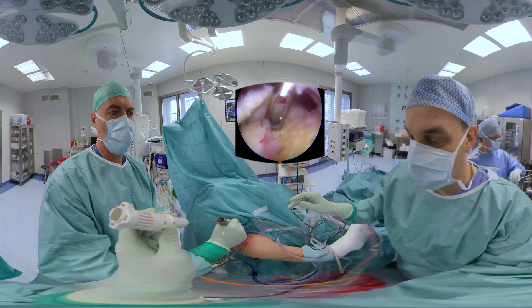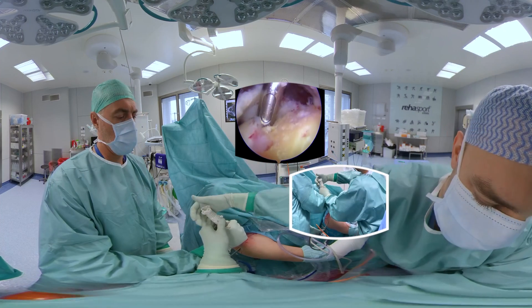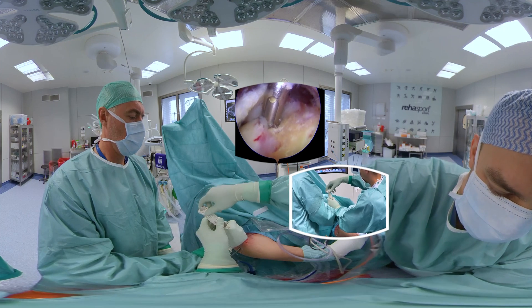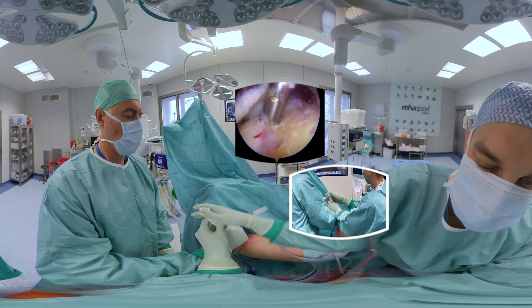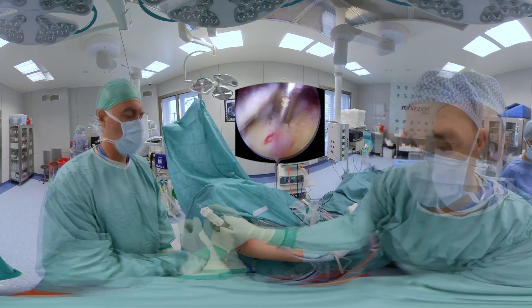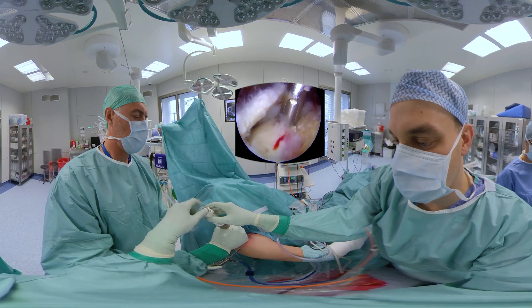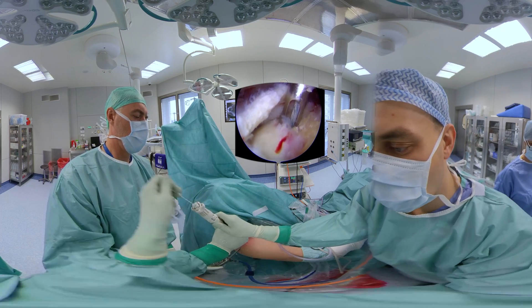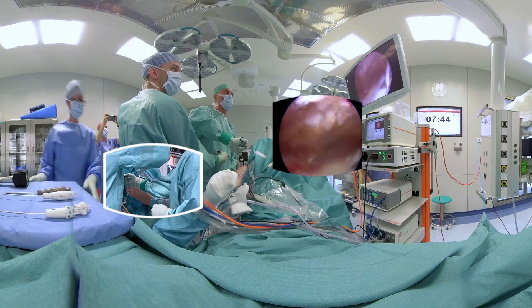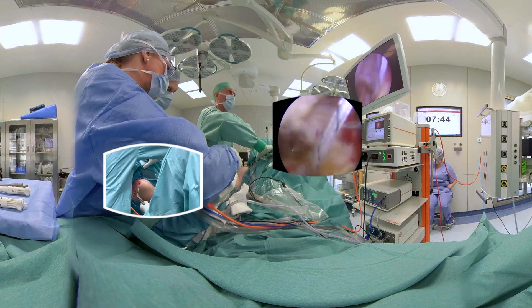After choosing the right portal with the needle, the first anchor is introduced. For the medial row, we are using an all-suture double-loaded knotless Cufix anchor, starting with the anteromedial position. All sutures are passed sequentially through the anterior part of the tendon.